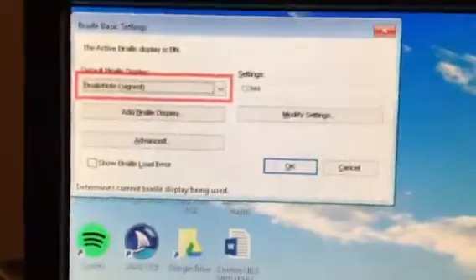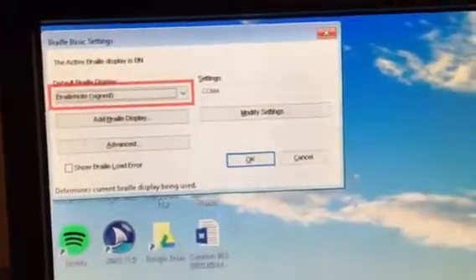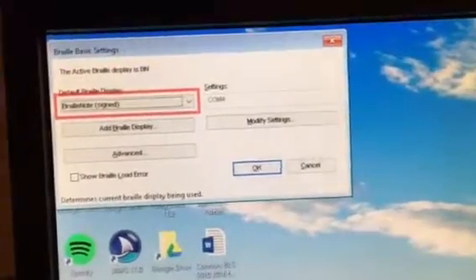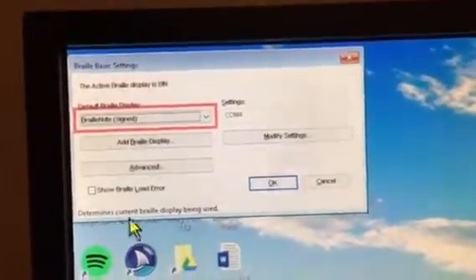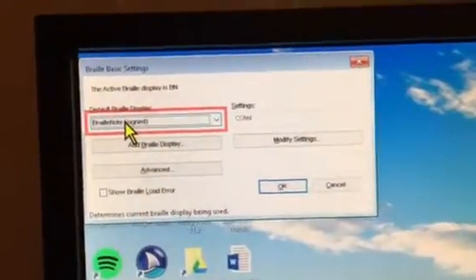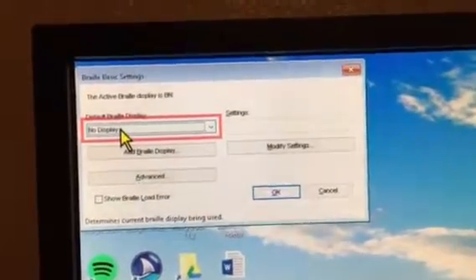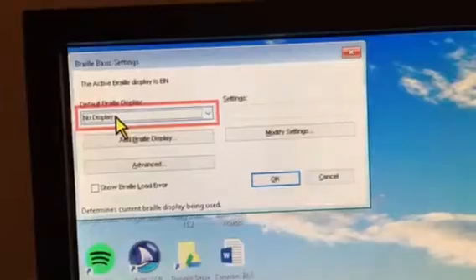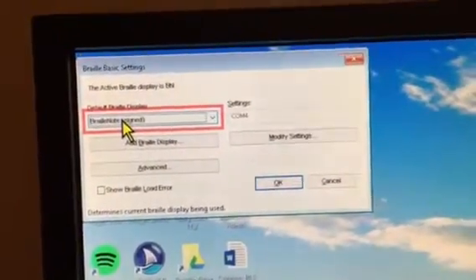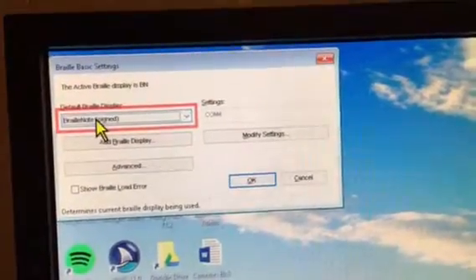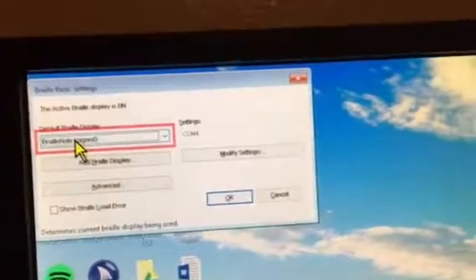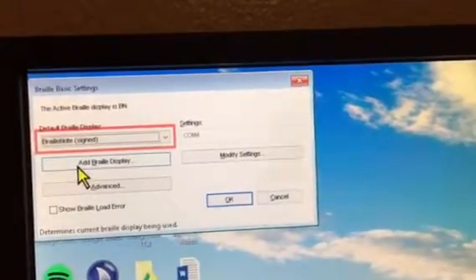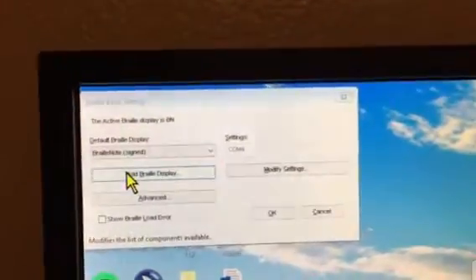Now mine's already connected, but to get yours to connect you'll want to go to the default option, default Braille display, which you're already on. You'll use the up and down arrows on the keyboard to figure out which display you want. Right now it says BrailleNote. You're going to have it on that, and then you're going to press Add Braille Display.